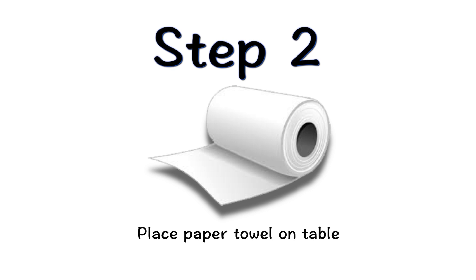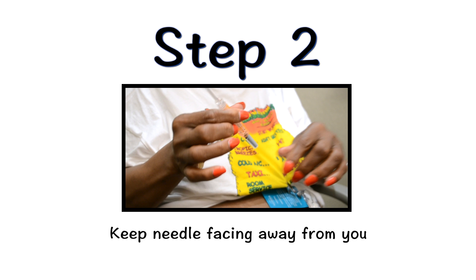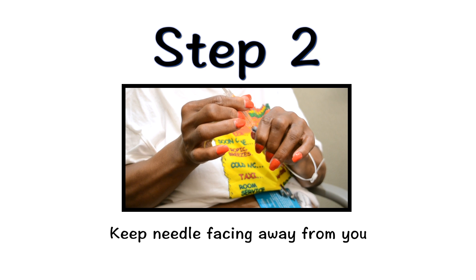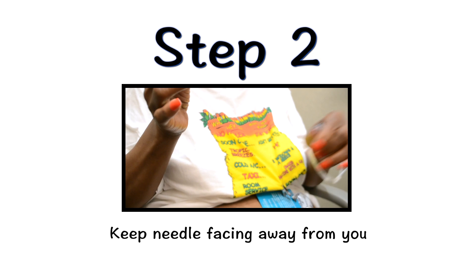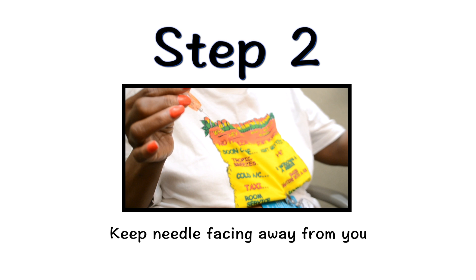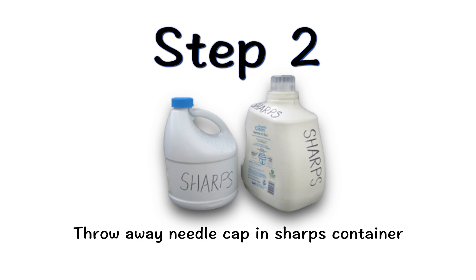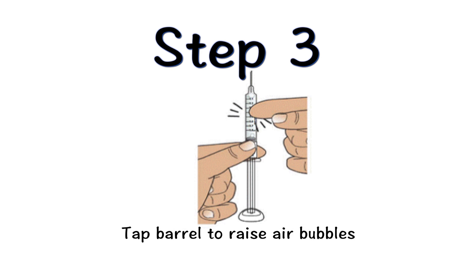Place a piece of paper towel on the table. With the needle facing away from you, hold the syringe firmly in one hand and pull the needle cap straight off, extending your hand away from the needle. You may need to adjust the medicine level for your prescribed dose. Do not recap the needle now or after the injection. Throw away the needle cap in a sharps container. Before you adjust the medicine, hold the syringe with the needle end facing up and gently tap the barrel to make sure any tiny bubbles rise to the top.